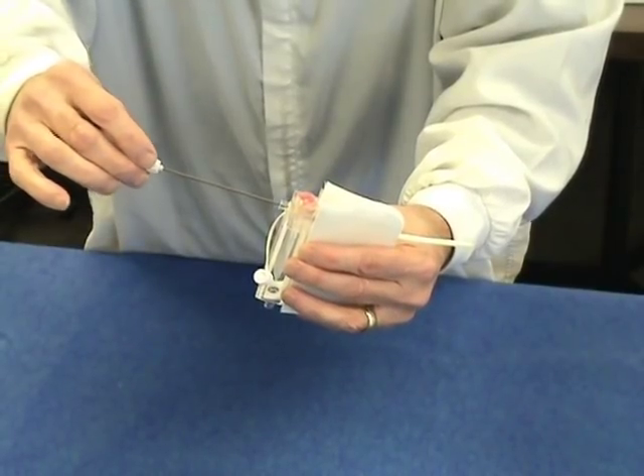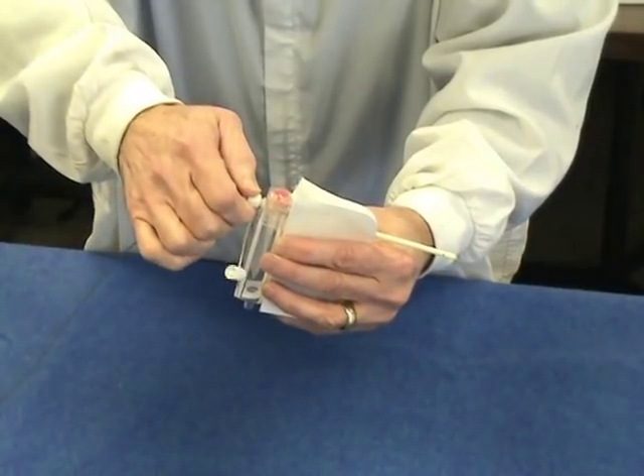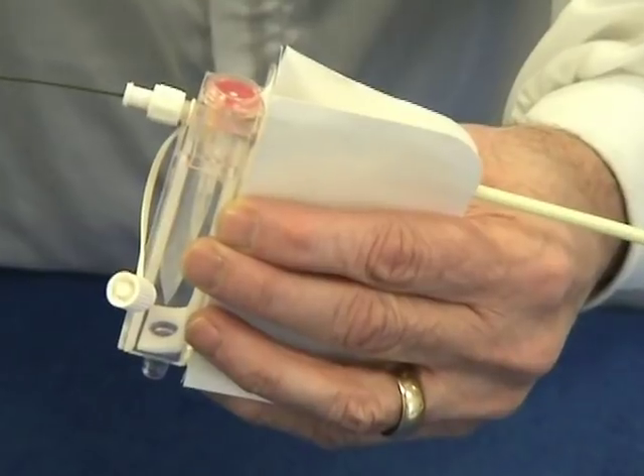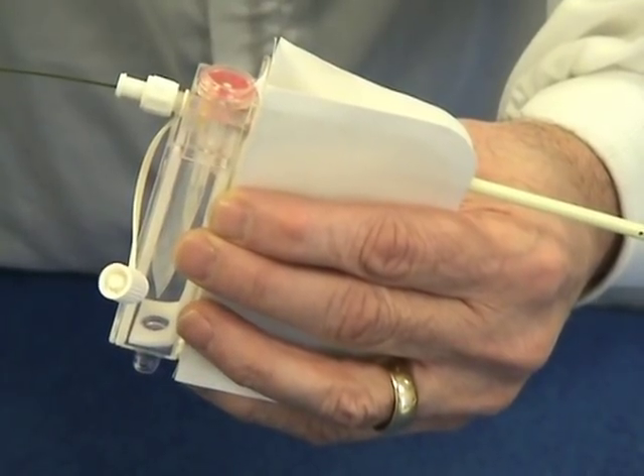An over-the-wire cannula can be purchased separately for introduction of the catheter using the Seldinger technique. The cannula is only available for the TV 1113 thoracic vent.